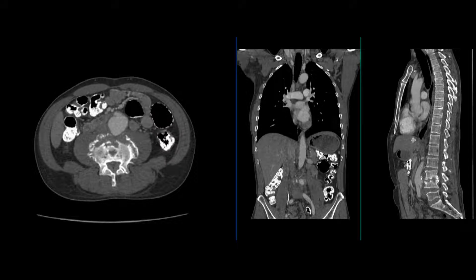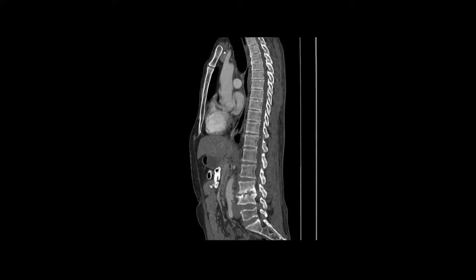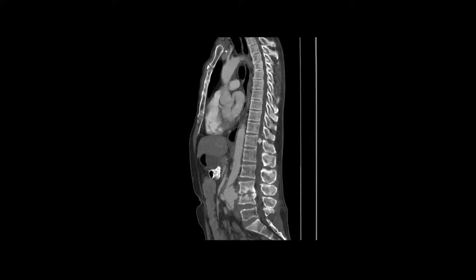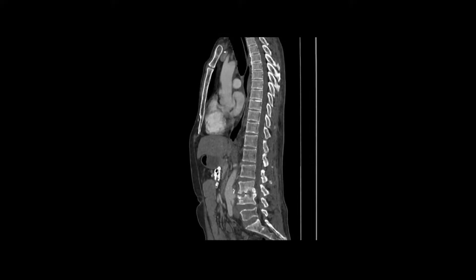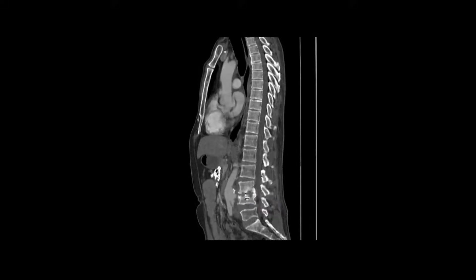Looking at the sagittal imaging at that level, the intervertebral discs are essentially obliterated. There is destruction of the bone and possibly a mild soft tissue component.